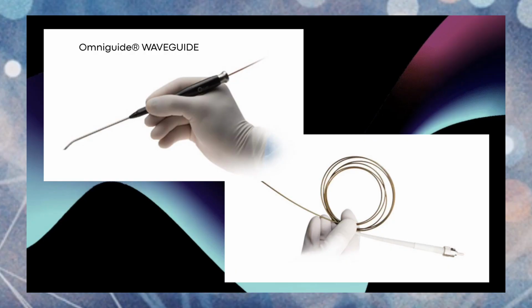So it is completely acceptable and common to be working with a fiber, and if you have a long use for it, for a specific kind of case, it may stop working. And the companies handle that fact by not charging you for more than one fiber. So this is a common practice. You have to make sure, if you have this kind of technology, that you have that kind of agreement.